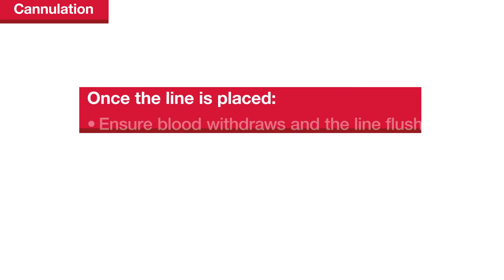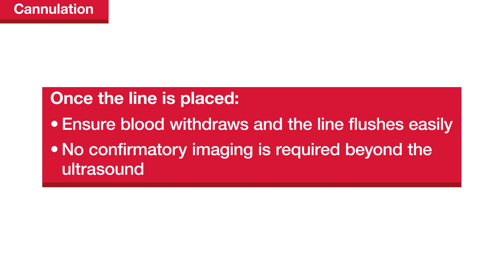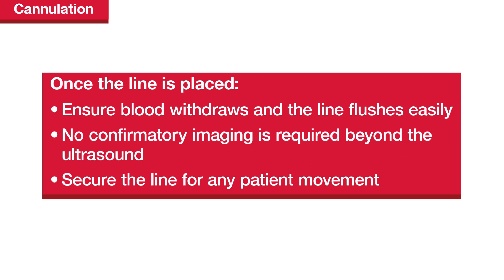Once the line is in place, ensure that blood withdraws and the line flushes easily. Unlike neck and chest lines, no confirmatory imaging is required beyond the ultrasound. If the patient needs to be repositioned, the line should be securely fastened during the maneuver, just as with any other IV access line.